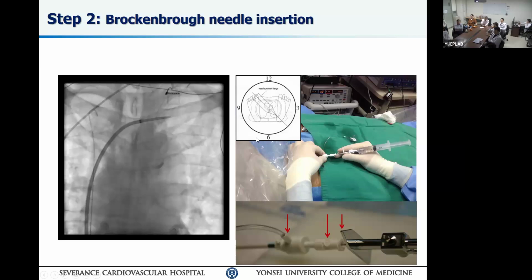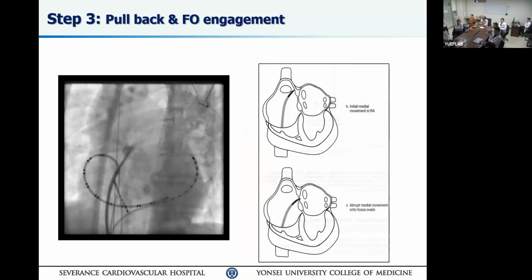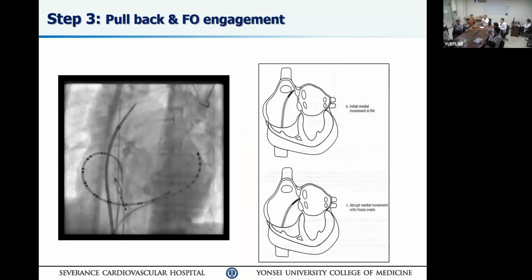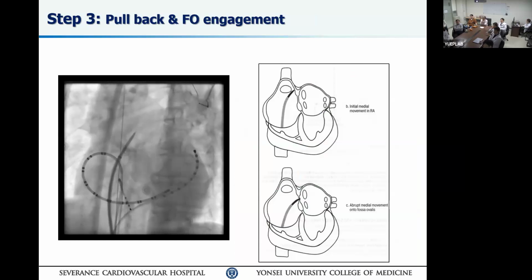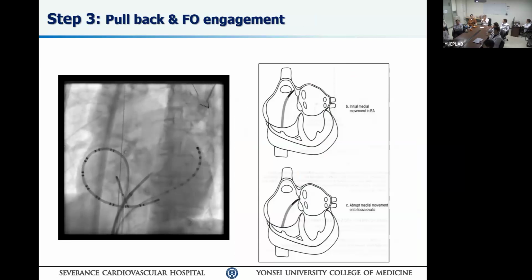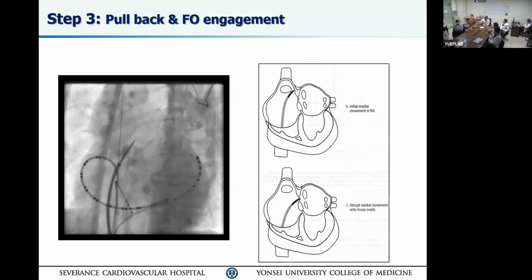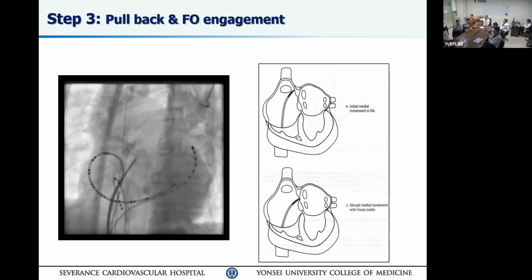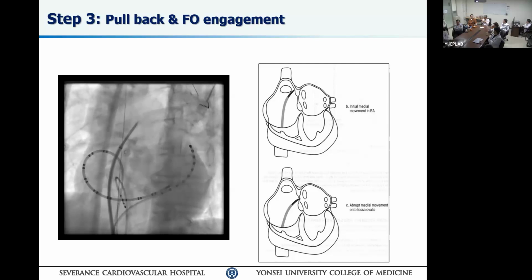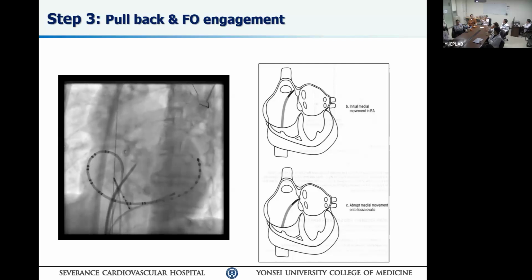Keep going there. Now this is important. When you're dragging here, for the first time for you guys to do, the next structure to the SVC, what do you have in CT? Ascending aorta, right? SVC here, ascending aorta here. So the ascending aorta is going to be more anterior and leftward than your SVC. So when you come up, drag the sheath posteriorly. The SVC is a very soft vein. This is not a hard vein. The transeptal is going to shape the SVC like a tenting.